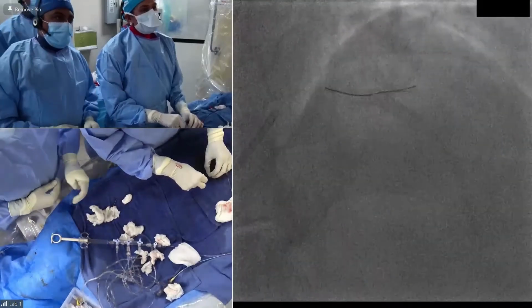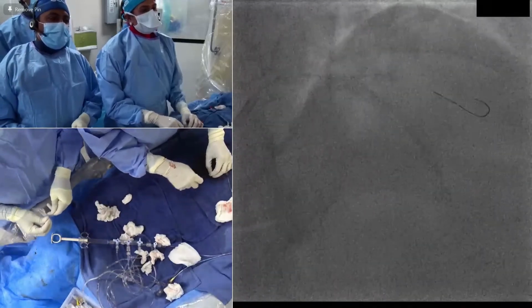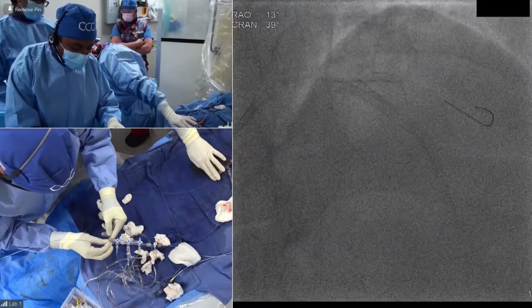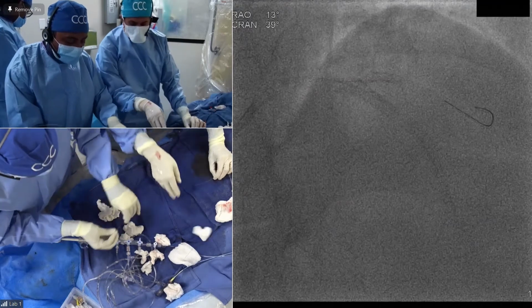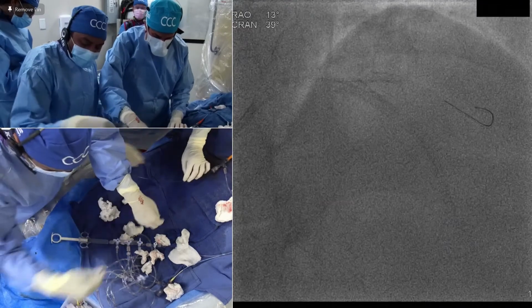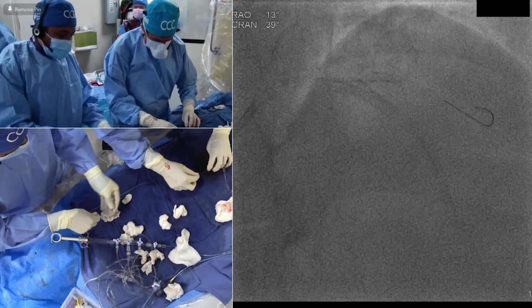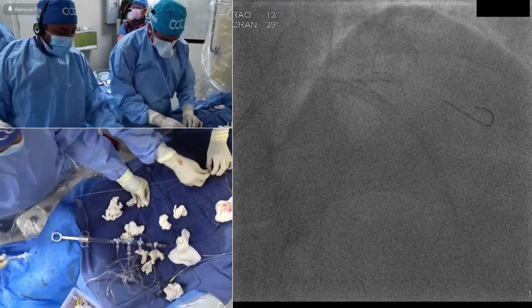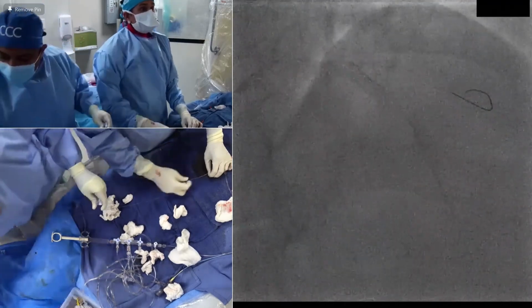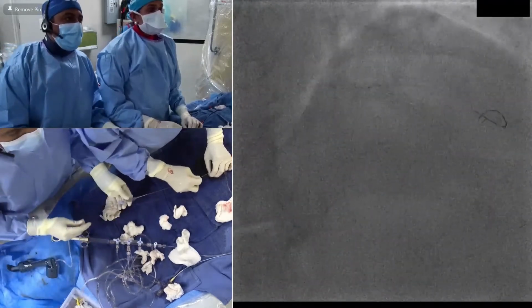See? Yeah, right there. It went. Of course, as soon as you ask for a new wire, that's when it's going to go. That's the trick. You have to say the magic words: open a new wire. Then it goes. Hasn't anybody noticed that? It happens all the time. But you have to really believe in those words when you say them. Otherwise, it doesn't work. If you fake it, then it's not crossing. And the nice thing is, you cross the side branch stent really towards the distal end of it instead of up top, which really helps get a balloon across.